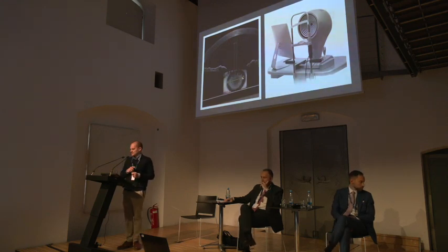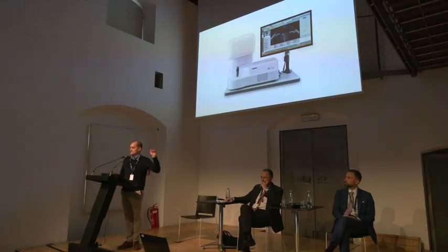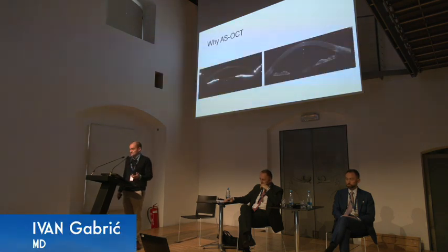So that's another type of device we see. And then we have Cassia, great device, great for ICLs, but again, it's pure OCT. It doesn't even have the little LEDs for K value measurements. So again, I wouldn't trust it doing biometry.